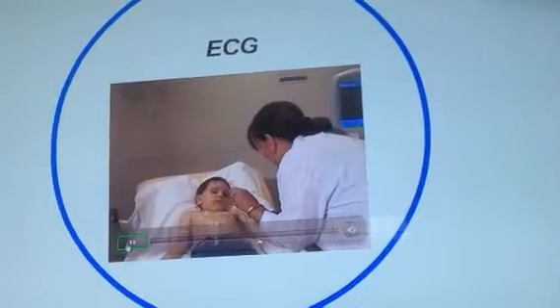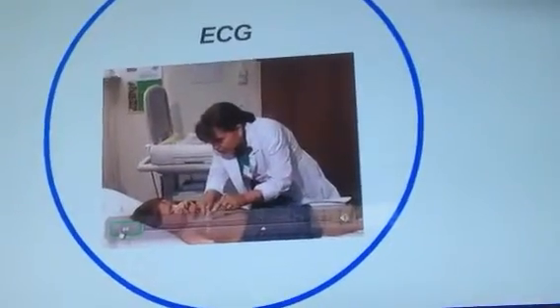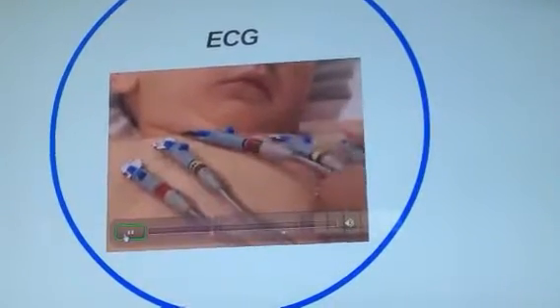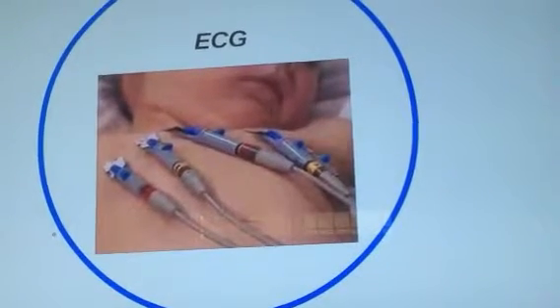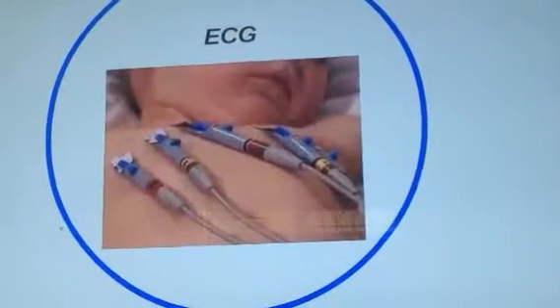For some patients, we may have a child life specialist assist by playing with the child to distract them and allow the cables to be more easily placed. The EKG machine only reads signals. It does not cause any discomfort to the patient. In this video, we could see the correct position of the electrodes in electrocardiography.